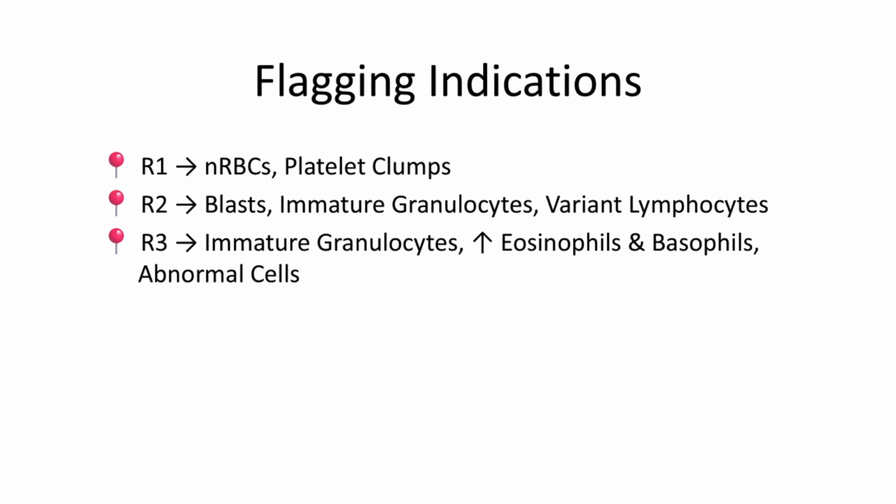In summary, the histogram curve shows the relative size distribution of lymphocytes, monocytes, and granulocytes, while the R flags alert the technologist to possible abnormal or interfering cells that require further review under the microscope or confirmation by additional testing.